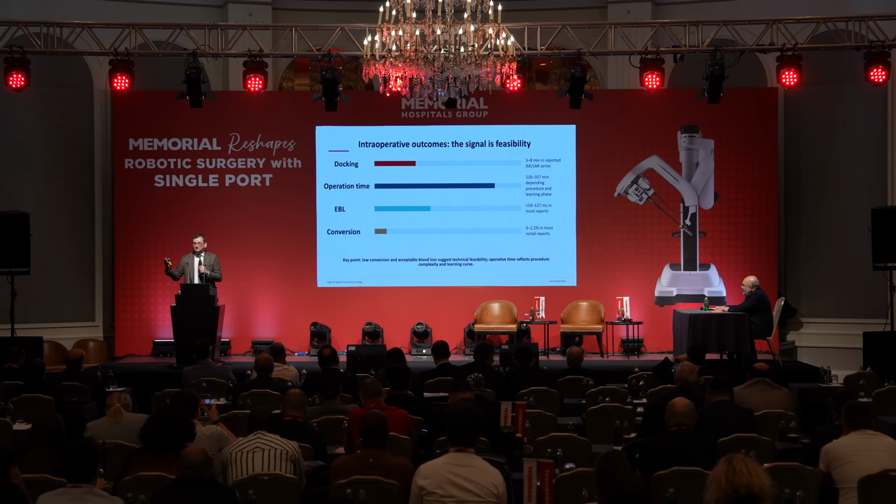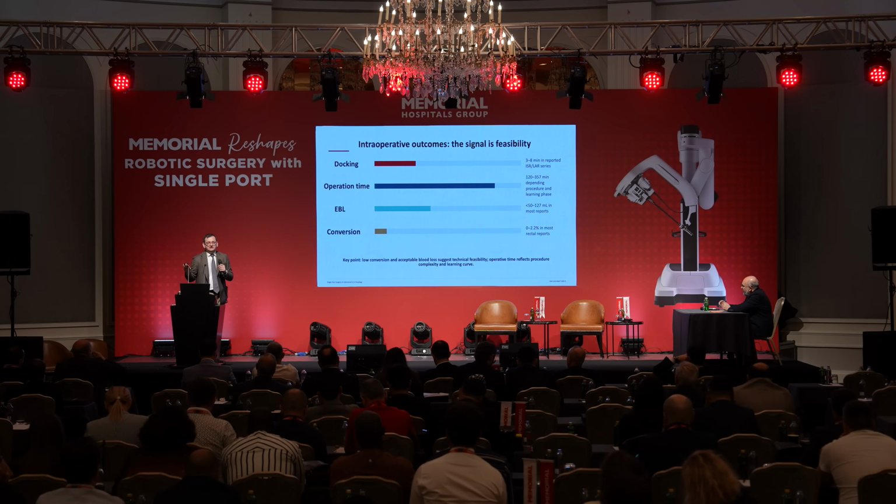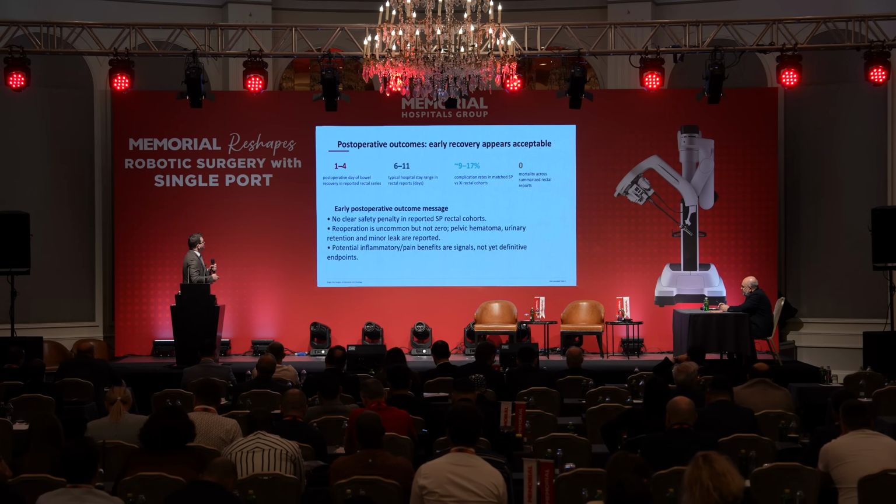This will take maybe 100 cases to learn single port. But for an expert in the field of multiport robotic surgery, I think it will take maybe 10 cases or fewer to apply these procedures in their routine practice.